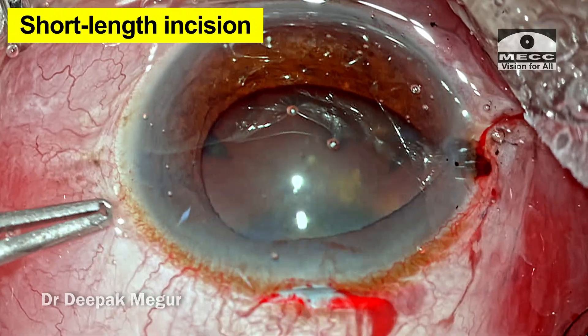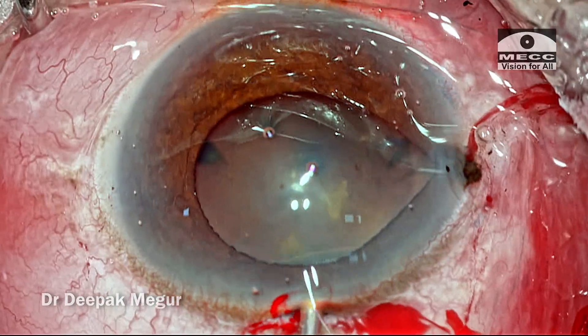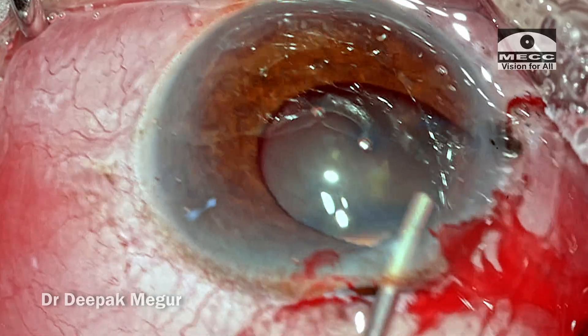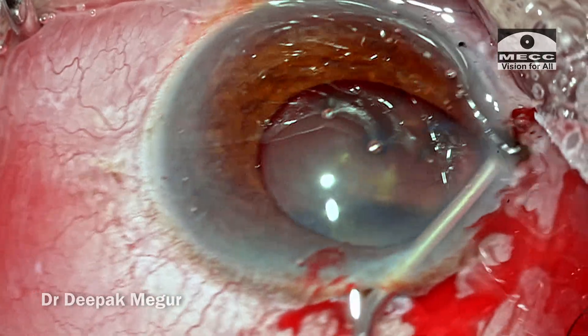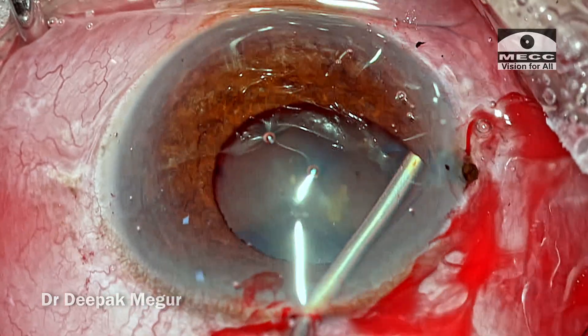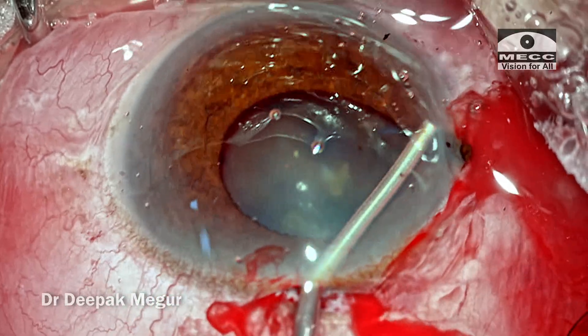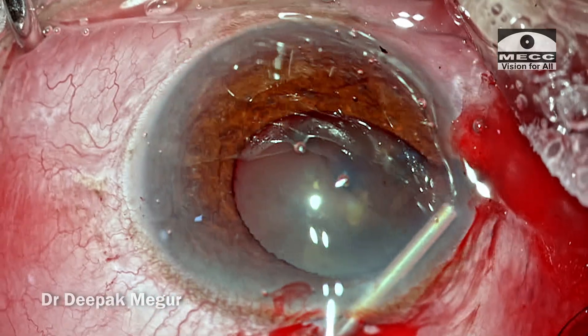He creates the incision — it's not right, and the iris starts to prolapse from the main incision as well. He goes in again with the visco cannula through the main incision and tries to pull back the iris from the right-hand side port, but is unsuccessful — iris is just pouring out from both incisions.